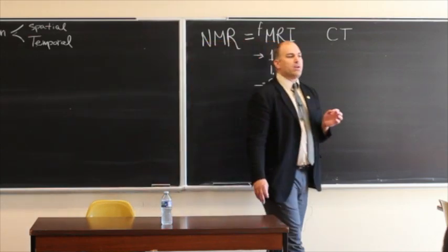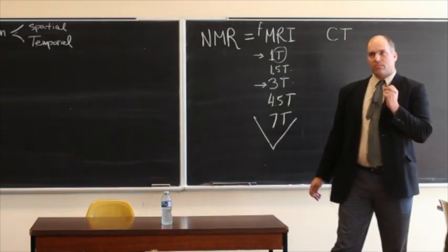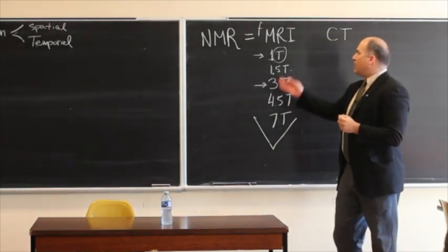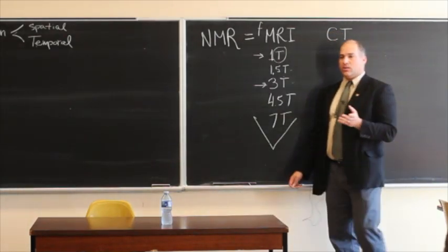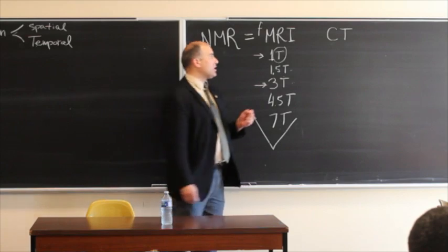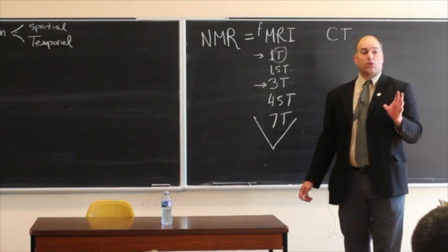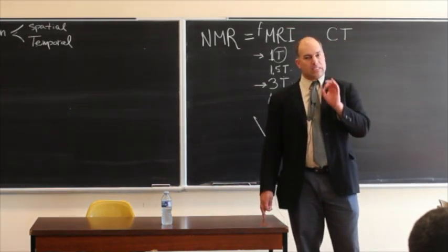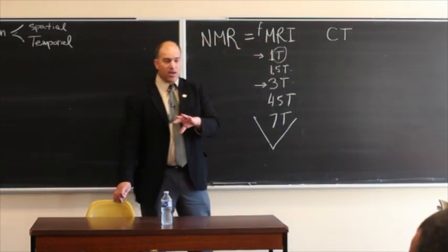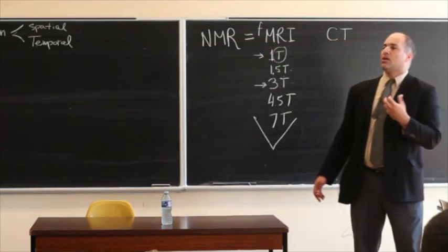But it's very important that you understand that the same thing is true here to a certain extent. So the whole power, impetus, or directive or potential of MRI has been largely shadowed by fMRI. The introduction of the letter F for functional magnetic resonance imaging is basically an innovation that uses largely the same technology. You do need a slight change in the hardware, and you do need a lot of changes in the software, but it is a slight change that suddenly allows you to see what is happening in the brain over time.